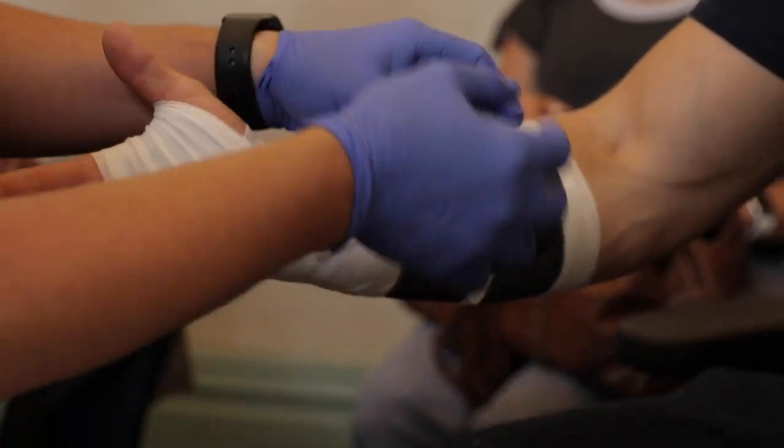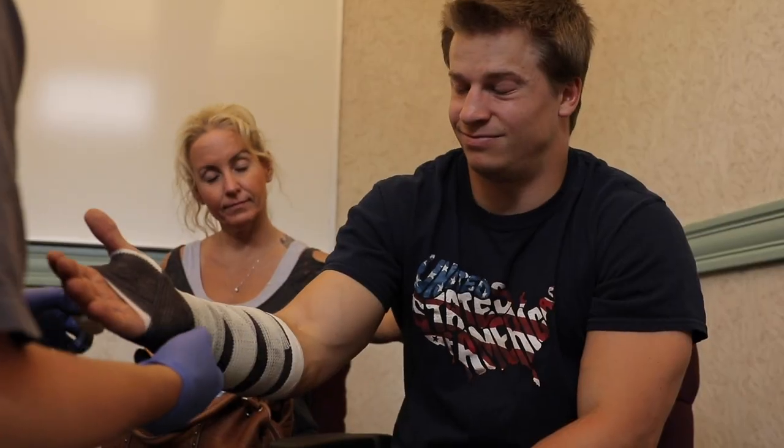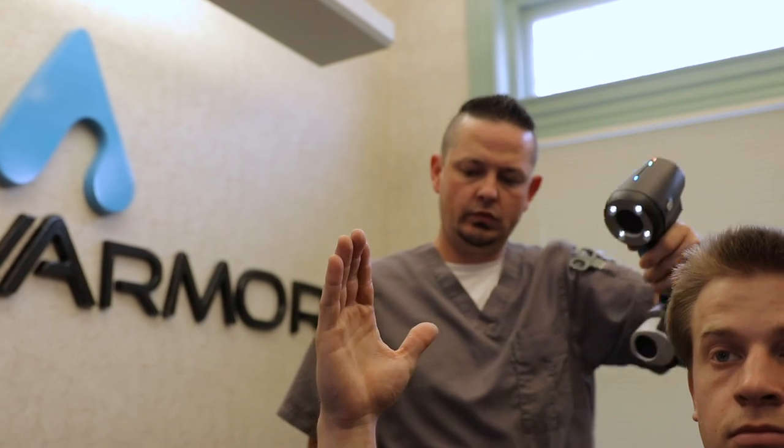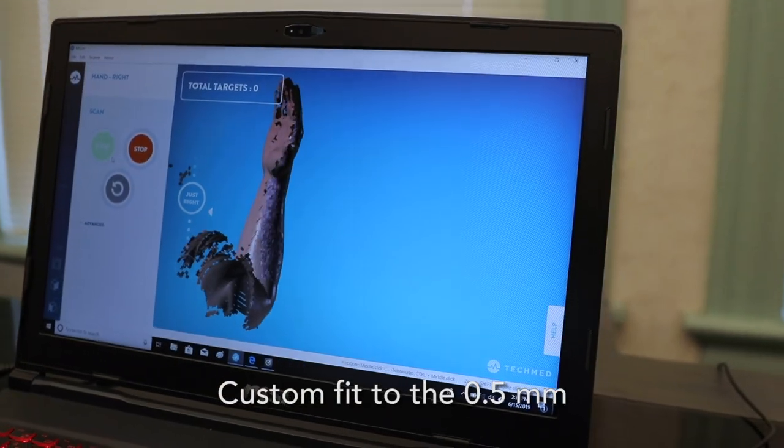But there was a possibility to make this better. The problem is that casts are a custom item — they have to be matched to the person who's wearing them, so custom wrapping a hand has been the only opportunity for a long time. But technology has finally caught up to where someone can scan an arm and send that back to a piece of software to create a custom model.